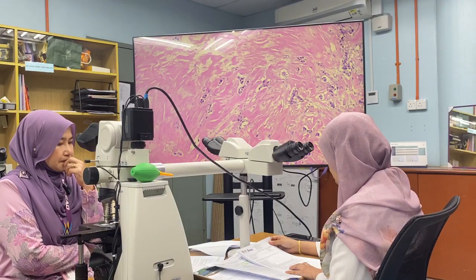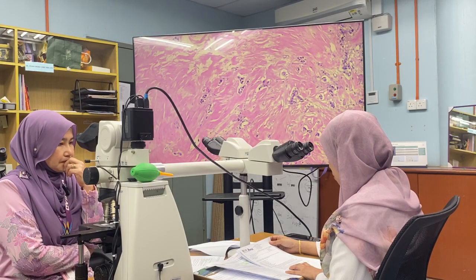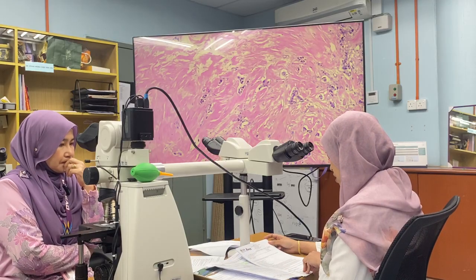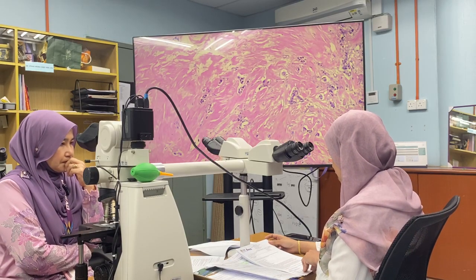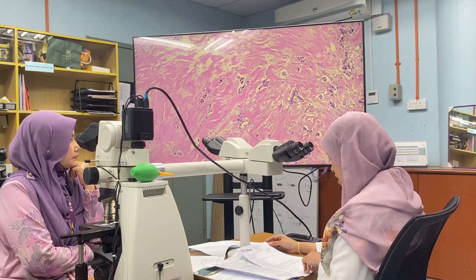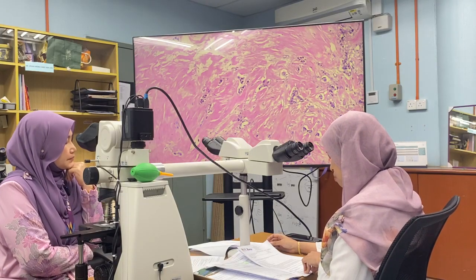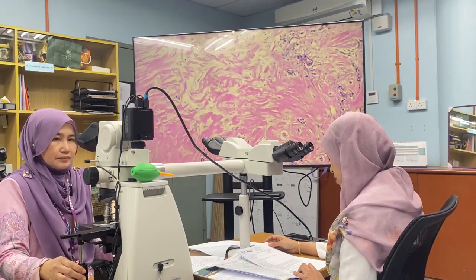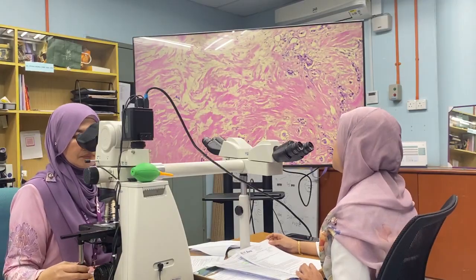Mitosis I counted is 3 in 10 high power fields, which corresponds to score 1, Bloom-Richardson. The malignant cells are seen infiltrating into the muscle layer and also the overlying epidermis. Otherwise no DCIS or Paget disease of the nipple appreciated. Of the 5 lymph nodes, all are positive for tumor infiltration.